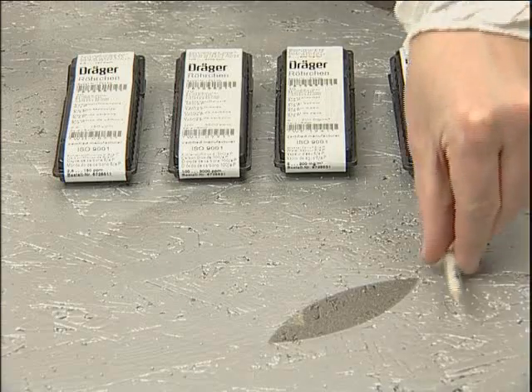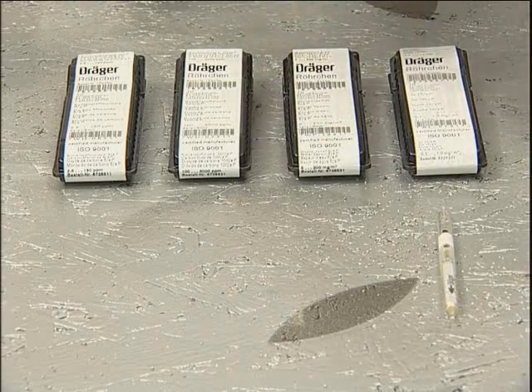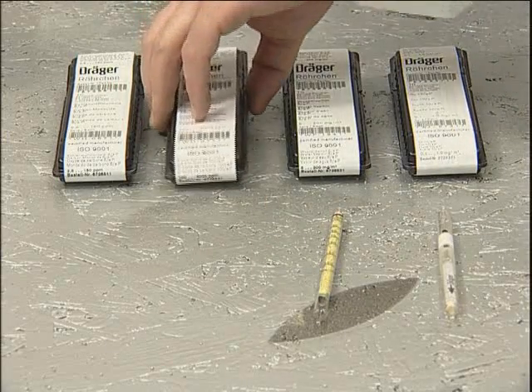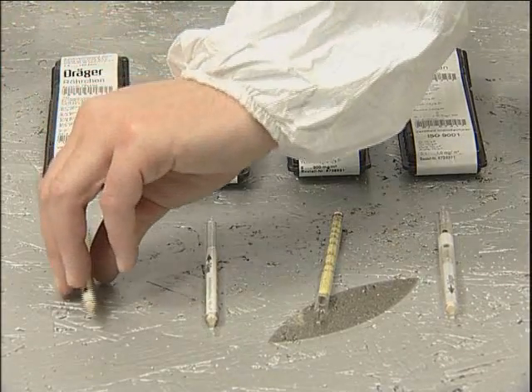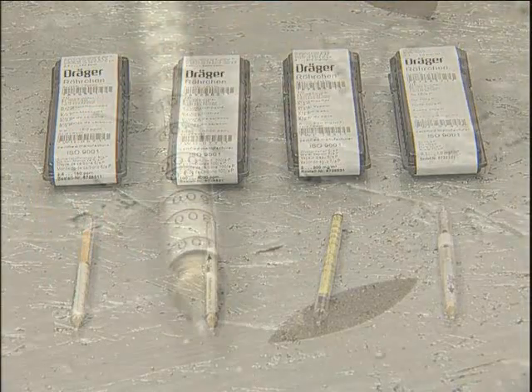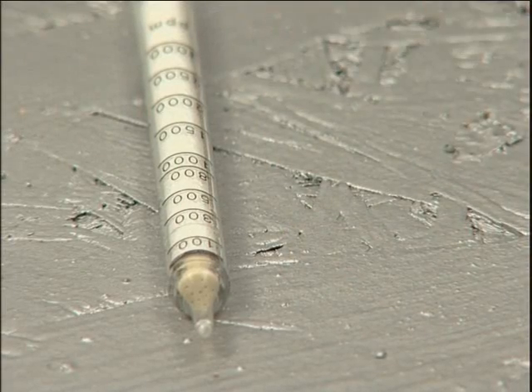These are supplied in packs of 10 per type and in most cases show the degree of contaminant present as a colour change to the crystals that they contain. There is one tube each for oil, water, carbon dioxide and carbon monoxide. The extent of the crystal colour change is read against the scale on the tube.